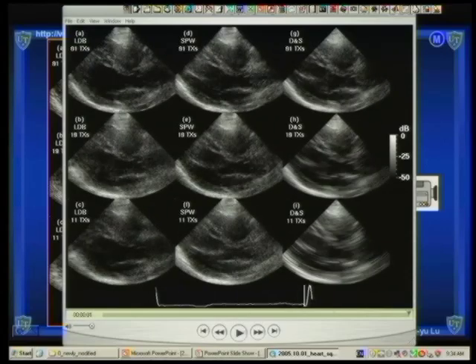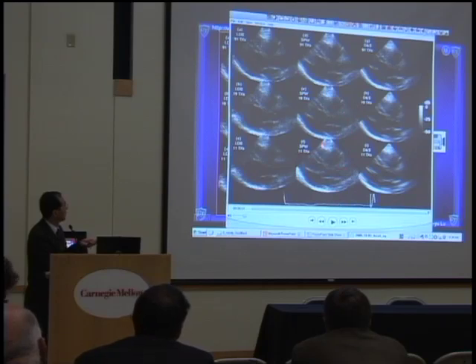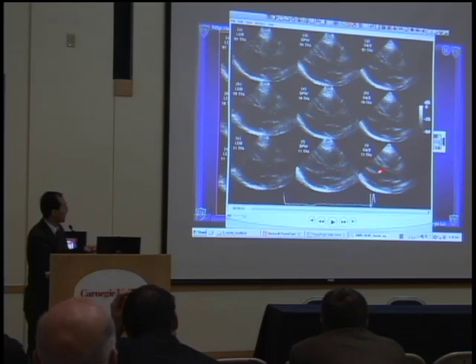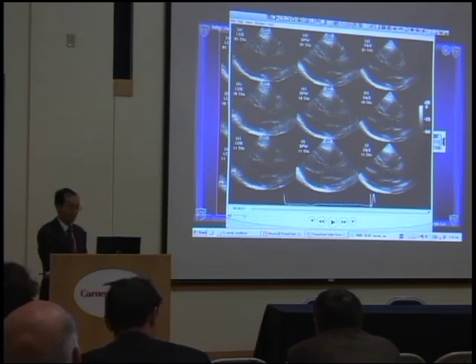So this is image results with limited diffraction array beam imaging with square wave aperture weighting with 11, 19, and 91 transmissions. And this one is still the plane wave, 11, 19, and 91 transmissions. And with the conventional focus beam, if you focus in narrow strips and then use interpolation to expand it into a 90-degree sector, it will be very fuzzy. And if you do this with 91 transmission, it's quite good, but 11 is quite poor.